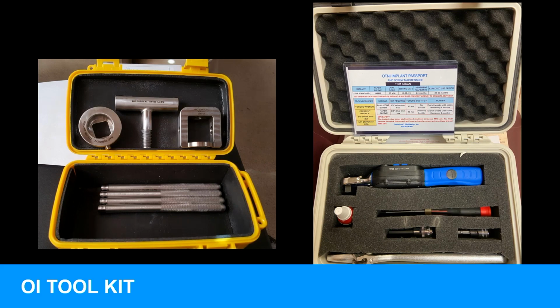I actually create the one on the right. The left one is a special one from Australia, and that includes stabilization tools plus a removal kit. It's called a puller, so that you can take on and off the abutment.